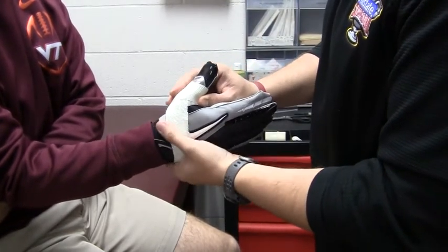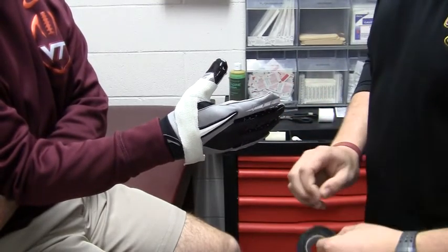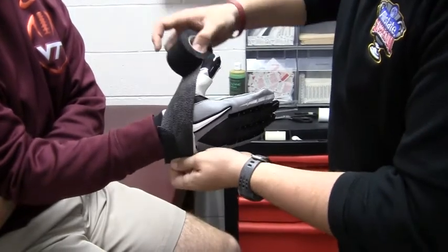Place the cast back on the athlete's hand. Secure the cast by applying 3 or 4 layers of elastic tape using the same figure-8 pattern used when applying the casting material.